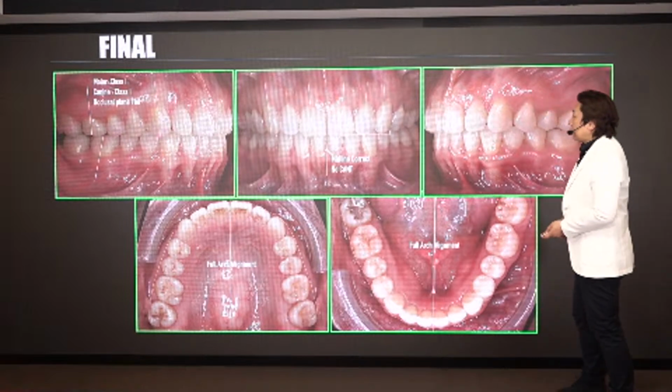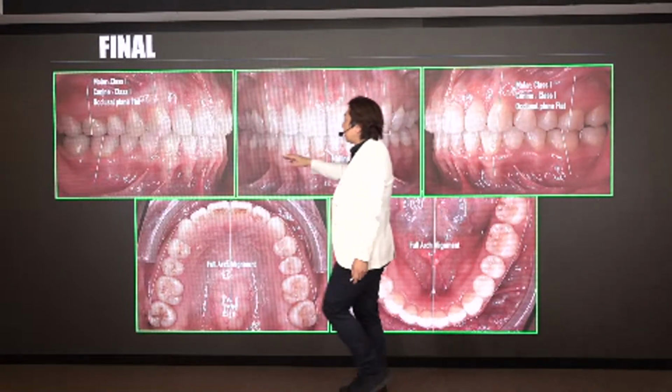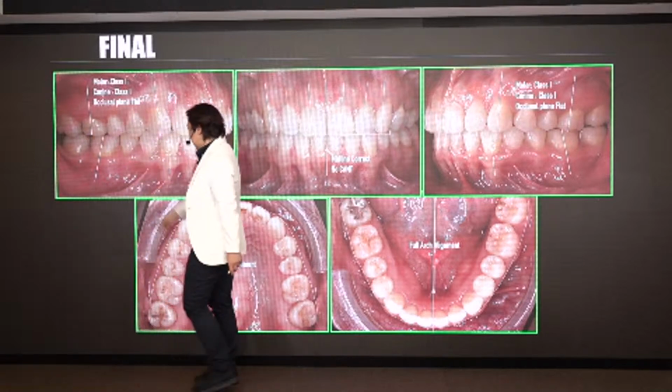Okay. This is the final situation. The midline is correct. No canting. This is the right side. The canine guidance is achieved. No posterior open bite. All the teeth bite is perfect.